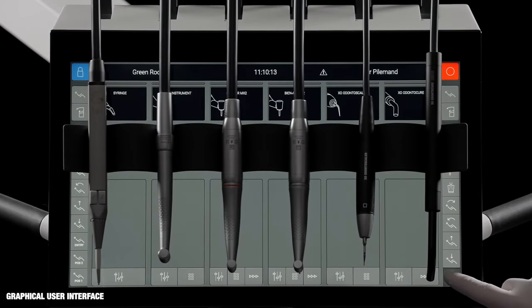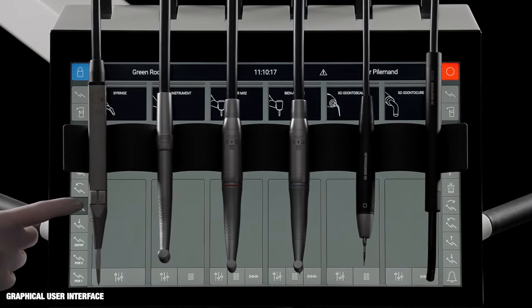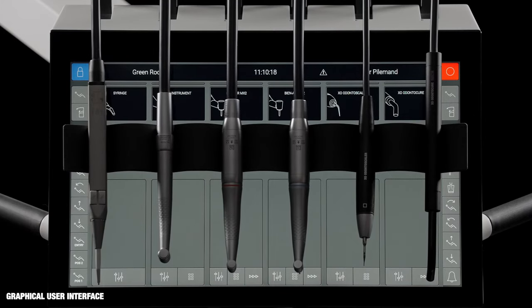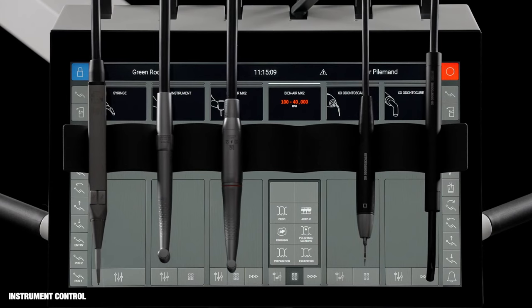Buttons on each side of the dashboard make it easy and intuitive to control all functions. Each instrument has a control window for setting up the instrument and a display for monitoring data.